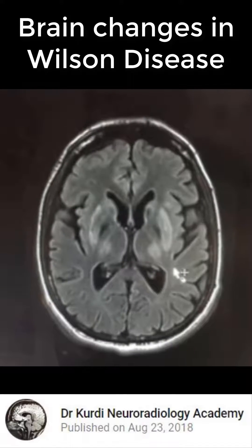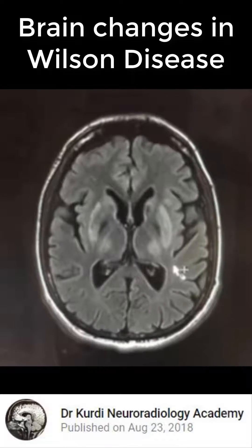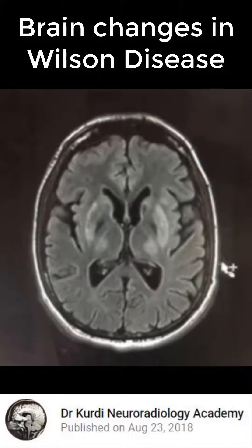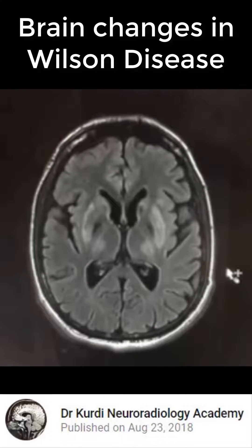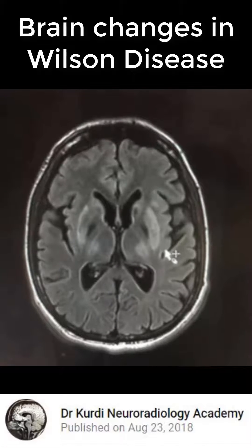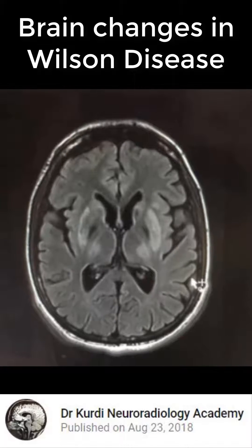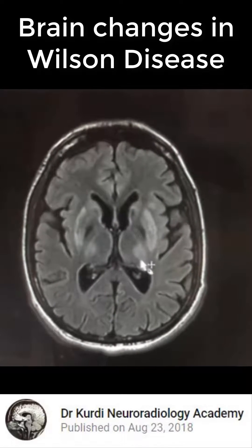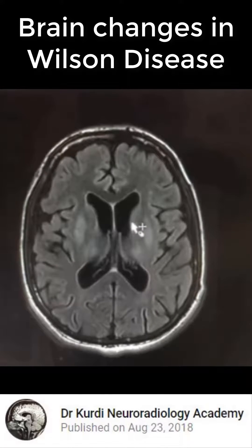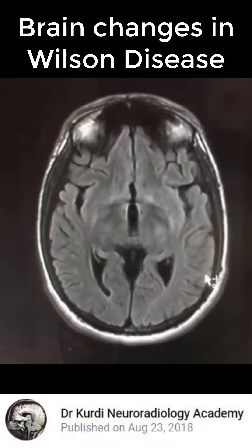This is a 25-year-old patient presenting with tremor. The FLAIR images are showing symmetric abnormality involving the basal ganglia, with both putamen involved, the lateral aspect of the thalamus, and the caudate nuclei — more specifically the caudate heads.